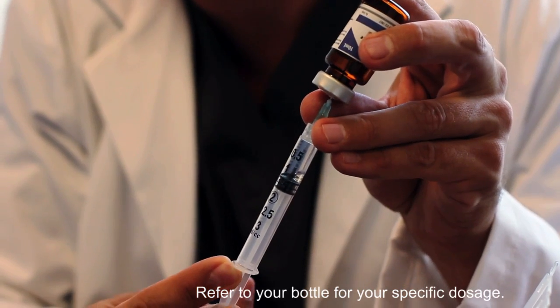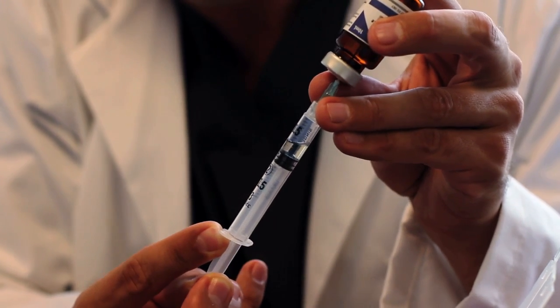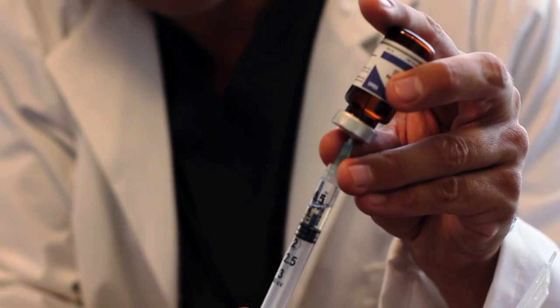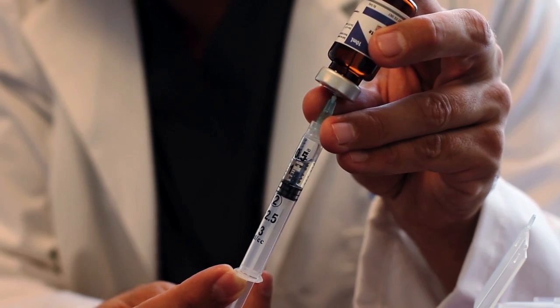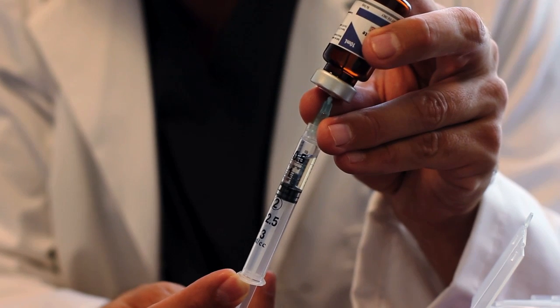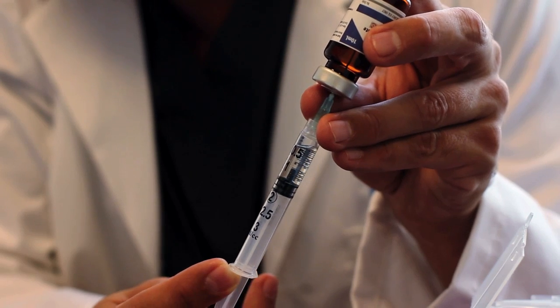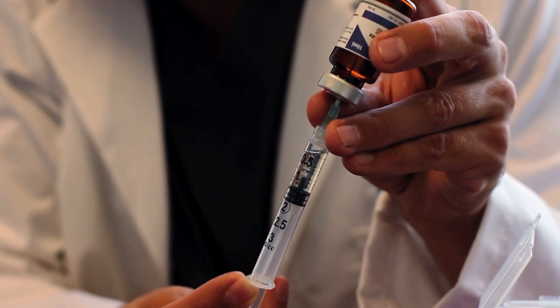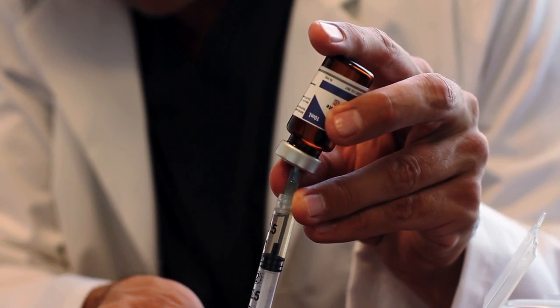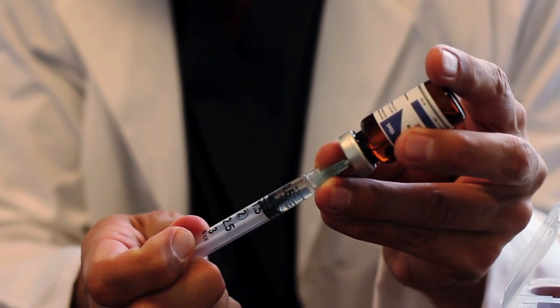Now you'll see that testosterone is made with an oil base and it passes through the needle very slowly. What I've done here is pull the plunger back to about 1.5 cc's, and you can see that very slowly the testosterone is filling up in the syringe. Once you get closer to the top of the syringe where it looks just about full, slowly start to push the plunger upwards. You'll see there's a tiny air bubble stuck at the top. By pushing the plunger upwards, all of that air is pushed completely out of the injection, and your plunger will be right at the 1 milliliter mark.